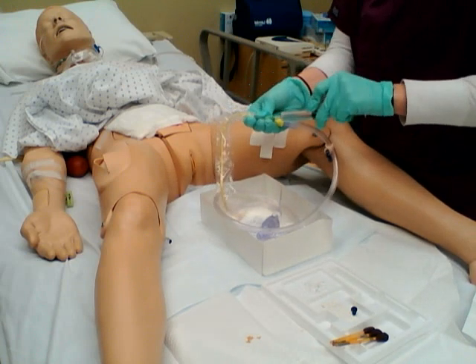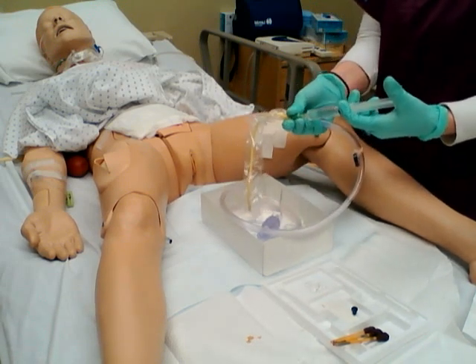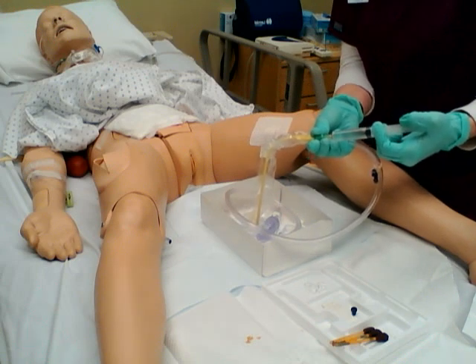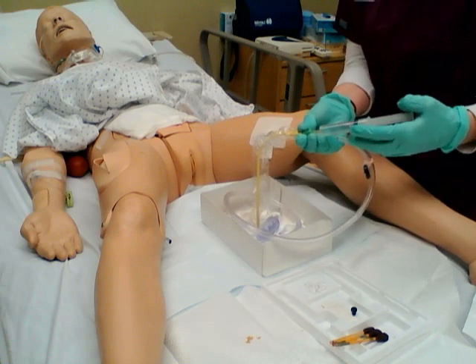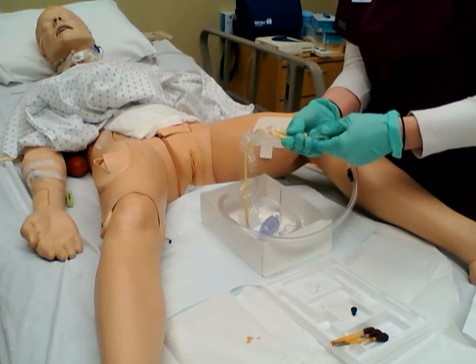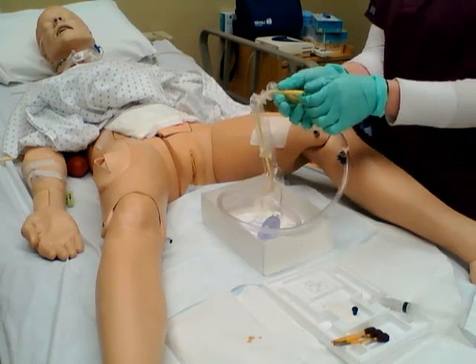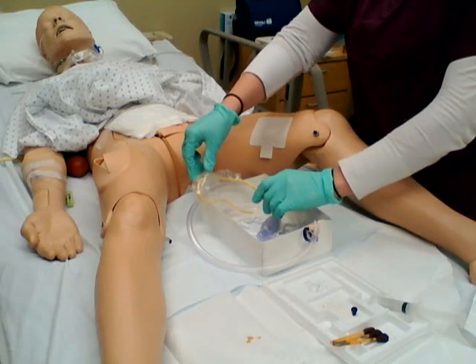Making sure that inside the plastic here, keeping it together. Inside the plastic here, I want to make sure that the balloon is inflating so that the catheter is working correctly, so that once we inflate the balloon inside the patient, it will work. And that did work. Now I'm just going to set that aside.